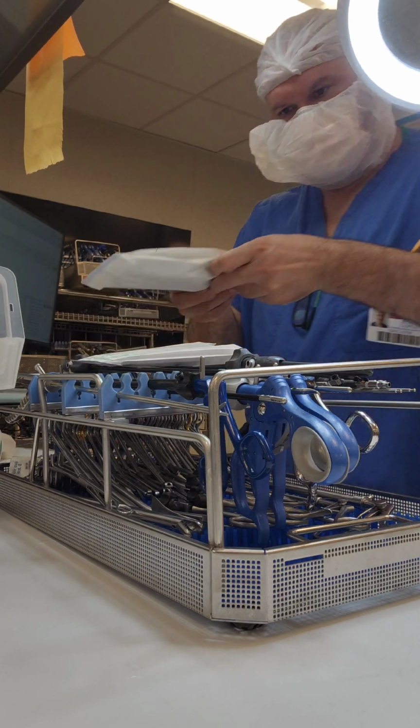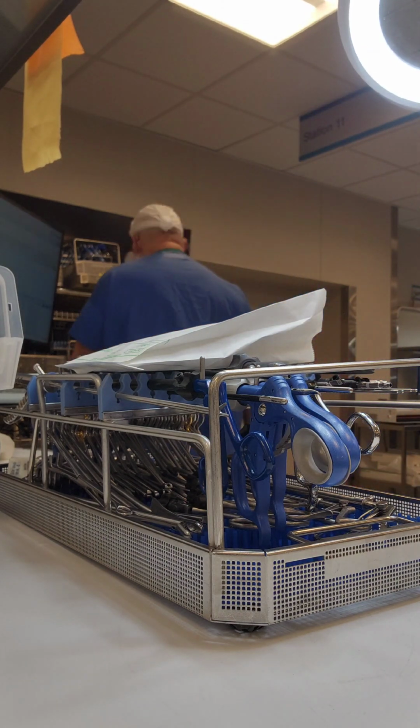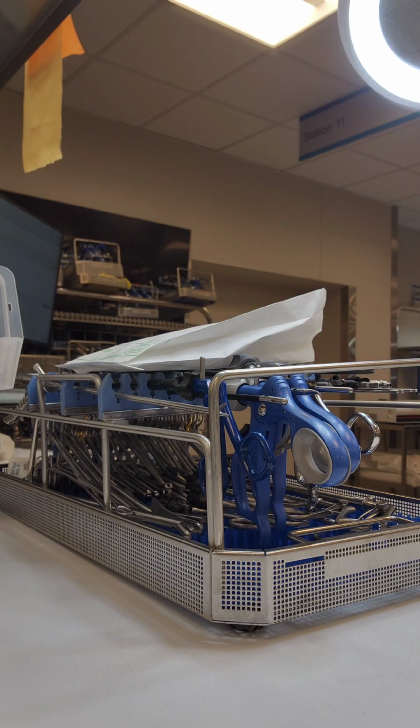So we didn't have any replacement feet on there. We should be able to replace those little feet. Those are actually really important. So check with your vendors to see if they have them. I know they sell them because I used to buy them before, for all of our baskets.